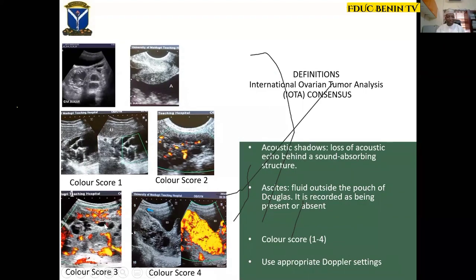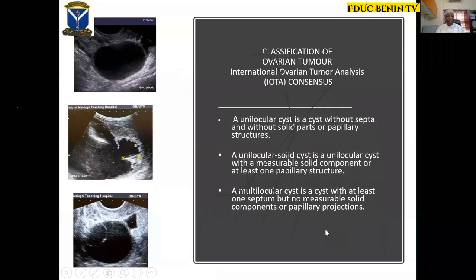This is a case of granulosa cell tumor, showing the expected blood flow. This uterus has a completely distorted architecture — this is choriocarcinoma, and this is the blood flow we expect in cases of choriocarcinoma. IOTA classifies ovarian tumors into five types: unilocular cysts, unilocular solids, multilocular cysts, multilocular solids, and solid tissue.